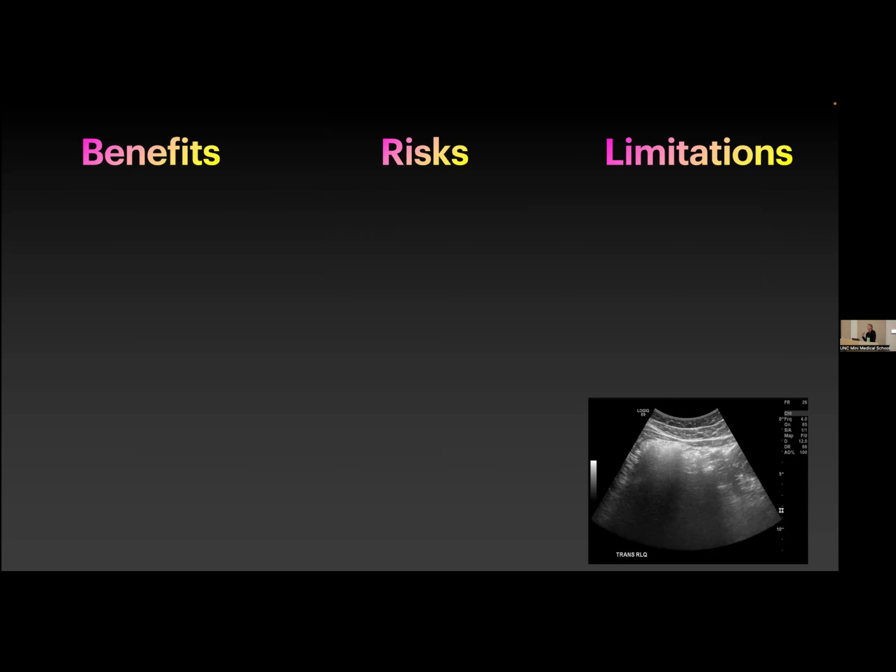So we might not be able to put you into the MRI in the magnet without potentially increasing your risk of having a problem related to that. So maybe we can make the diagnosis with ultrasound.